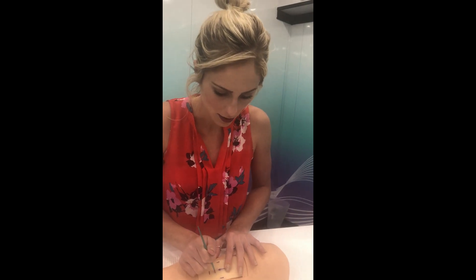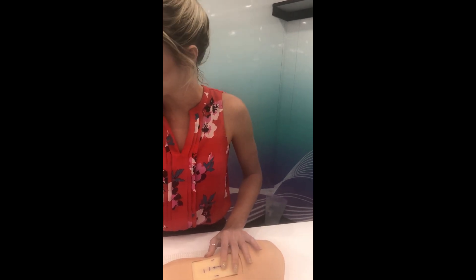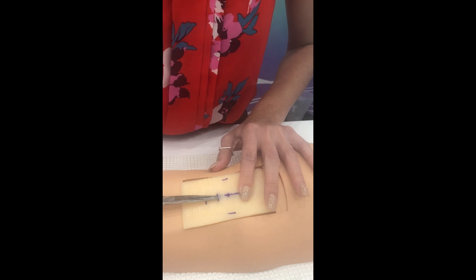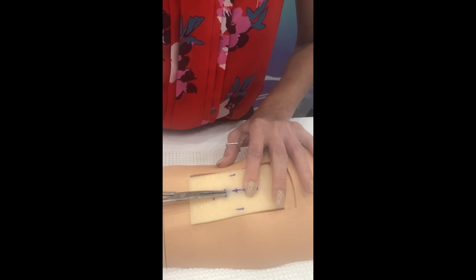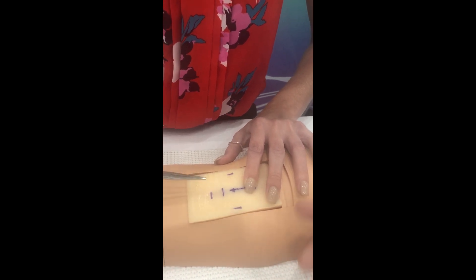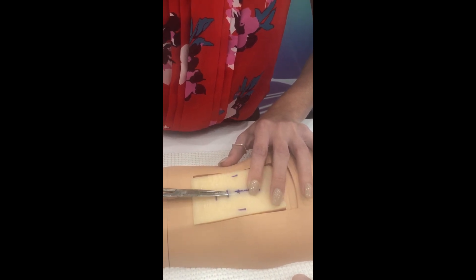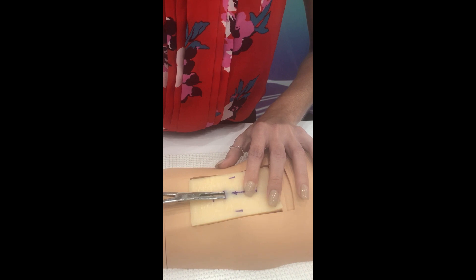I should have done it here. I did the wrong one — no, you're fine. Now pick up your clamp. Don't press so hard up here. 45 degrees, drop it. Now just slide it up and you'll feel the bottom of the sensor — you'll feel it. Open up the clamp and go around it — it's got to be all the way open. Grab it. Pull out the clamp. Turn it to 45, now drop it flat, all the way flat. Put your fingers in here. Now can you advance it? Do you feel it? Are you tapping the bottom? I'm tapping. I got it. There you go. Beautiful.